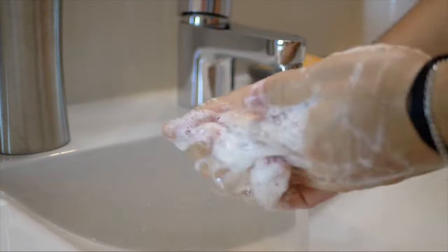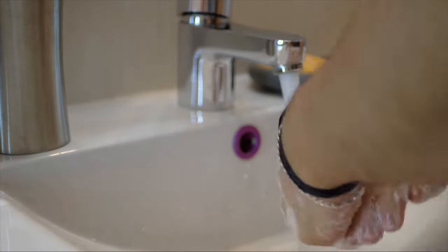So since I don't get these covered, I just use lubricant jelly, and this is super convenient. Comes in this cute little container, and I'm going to open this up and wipe it off with an alcohol swab, but not now because I'm not using it at the moment. All right, we got all those things situated, so let me go wash my hands. Okay, I hope you enjoyed washing your hands as much as I did.